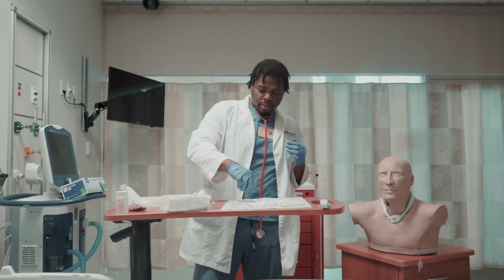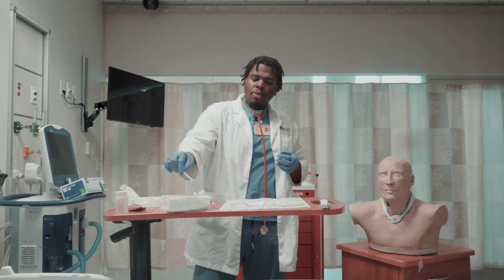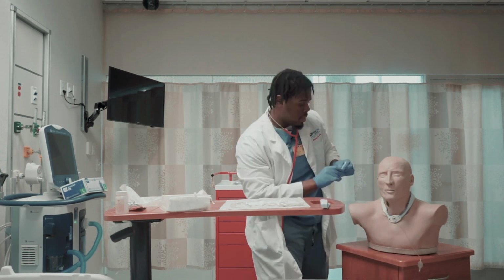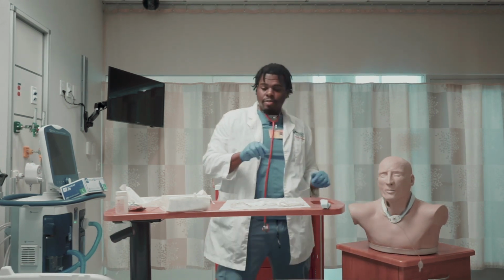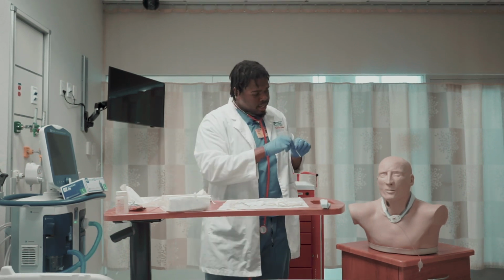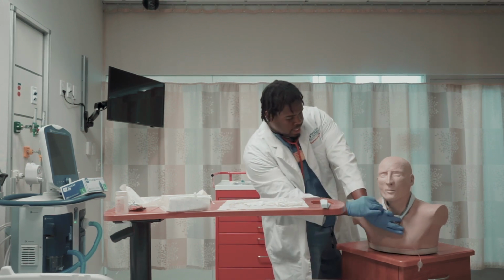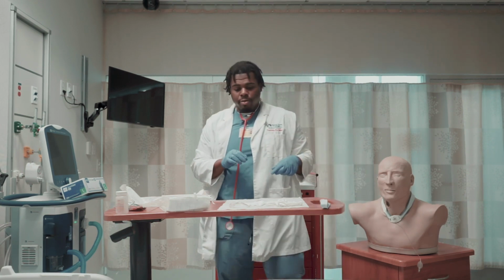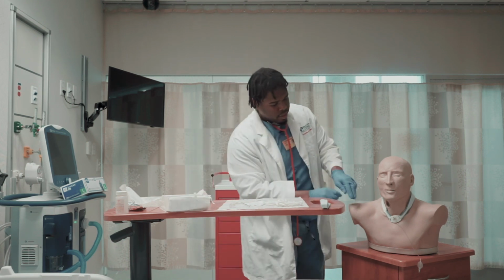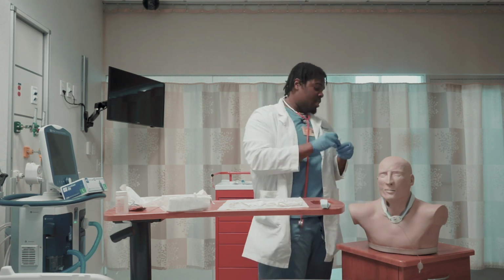Now I'm going to get my sterile cotton tip and dip it in the hydrogen peroxide. Swab under one time. Garbage. Get my other cotton tip, dip it in the hydrogen peroxide, swab one time over. Remember to hold on the flange. Garbage. I'm going to get my pipe cleaner, dip it in the hydrogen peroxide, and get those little crevices. Garbage.